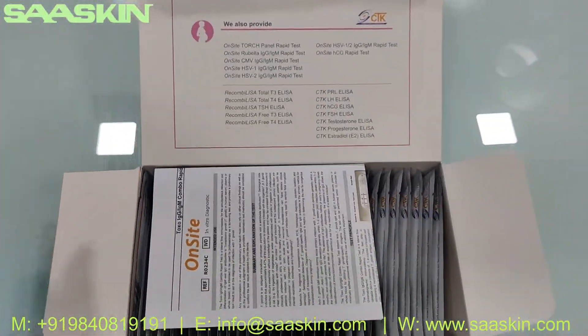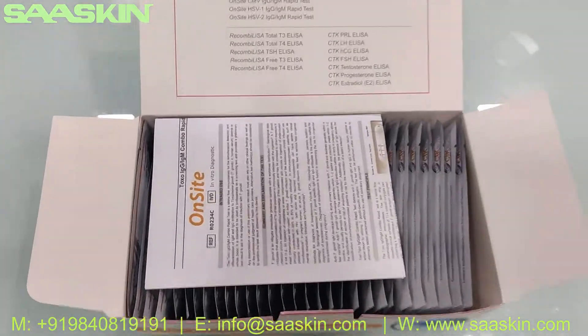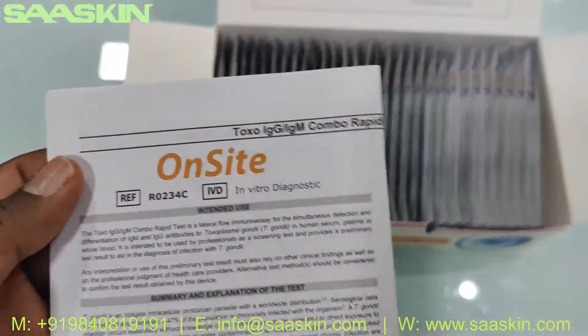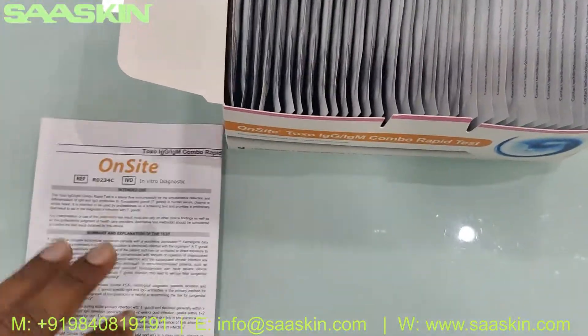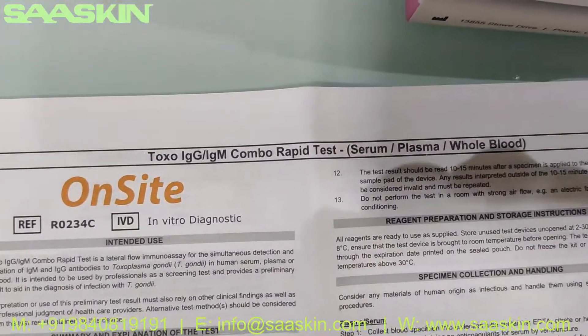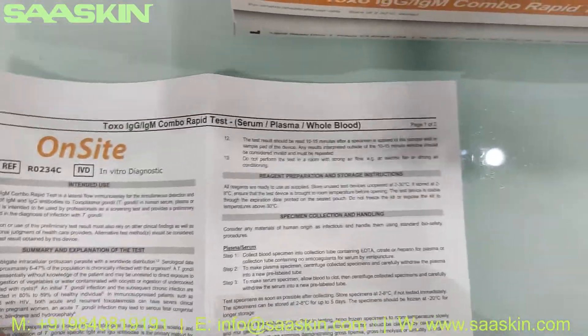Inside the box you get an IFU brochure — a complete instruction manual. The IFU brochure covers the On-Site Toxo IgG IgM Combo Rabbit Test.